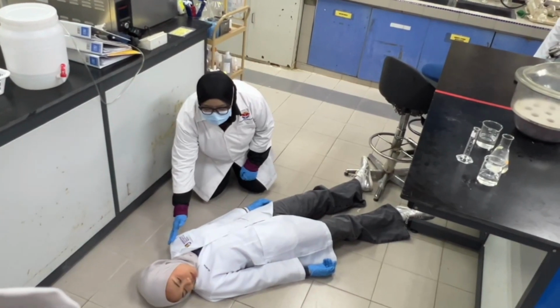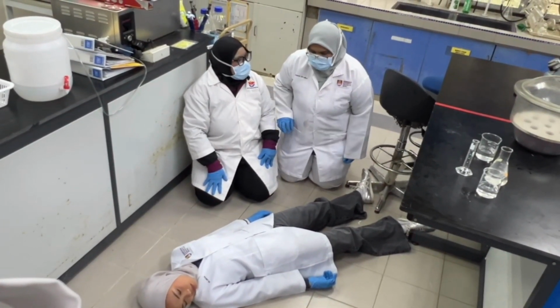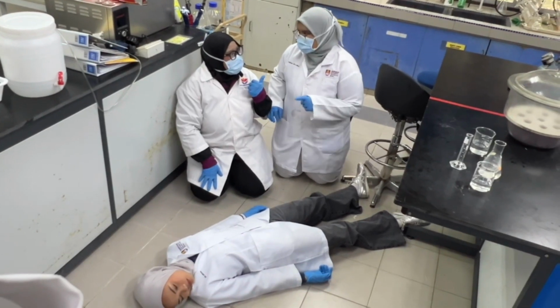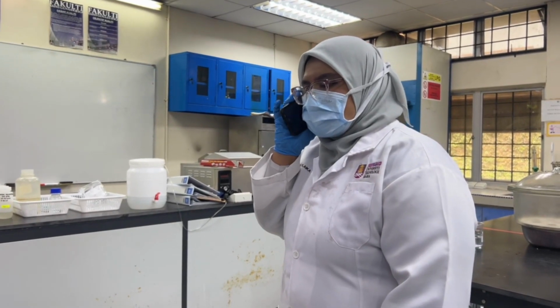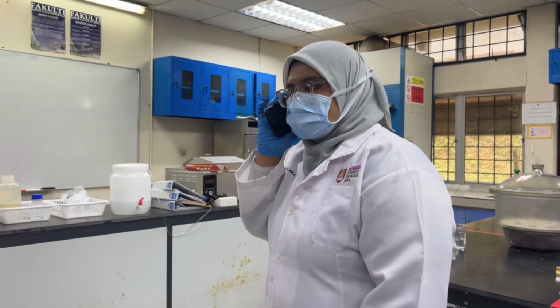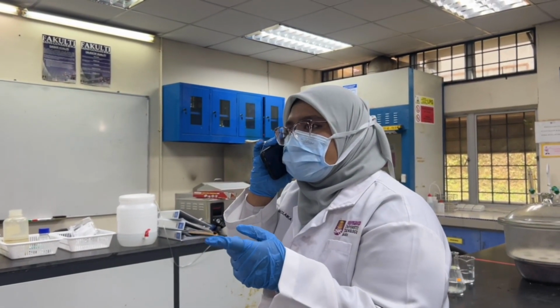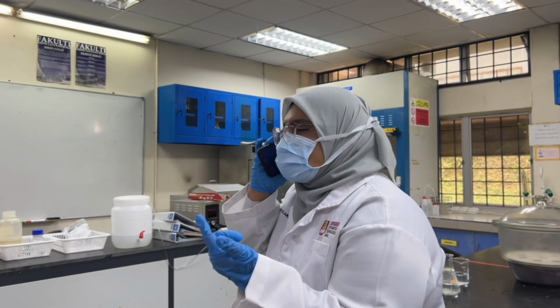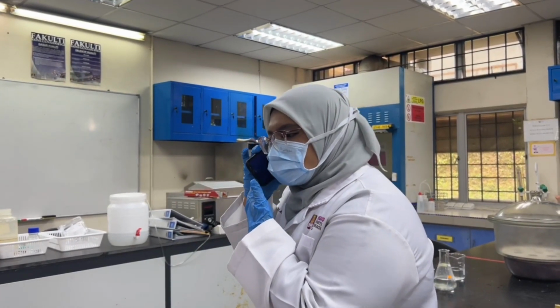Are you okay? Can you hear me? We have an unresponsive casualty. Can you help call 999? Sure, I will call 999 now. Hello, this is laboratory emergency. We have an unconscious casualty following suspected chloroform inhalation. She has been unconscious for 5 minutes. She had symptoms like headache, eye irritation, and dizziness. Okay.